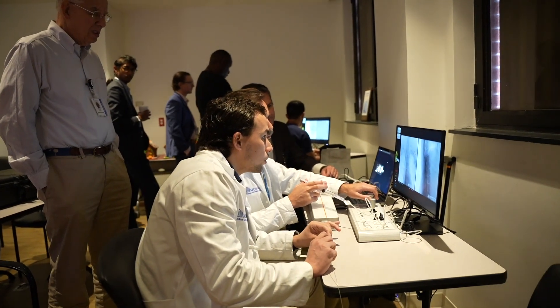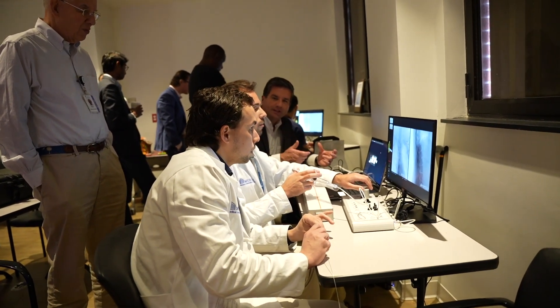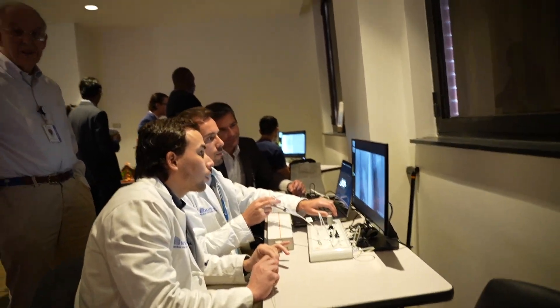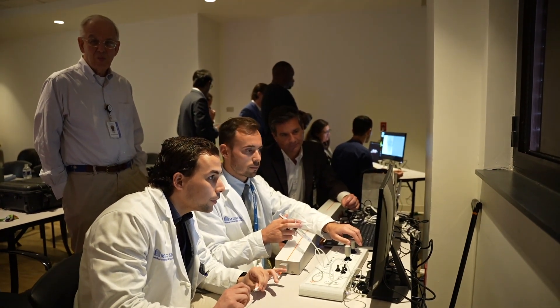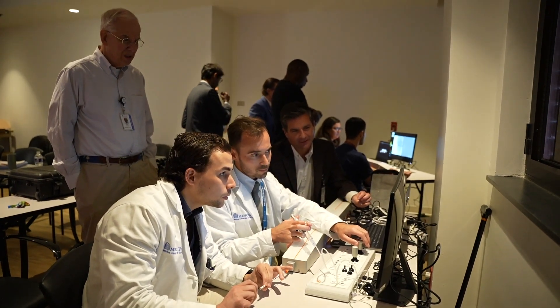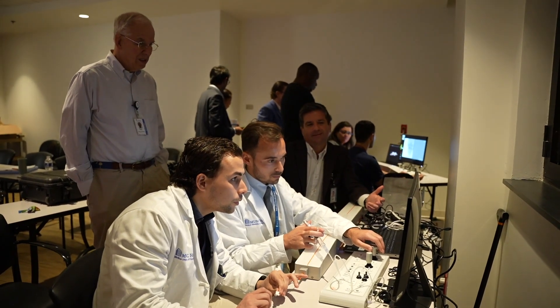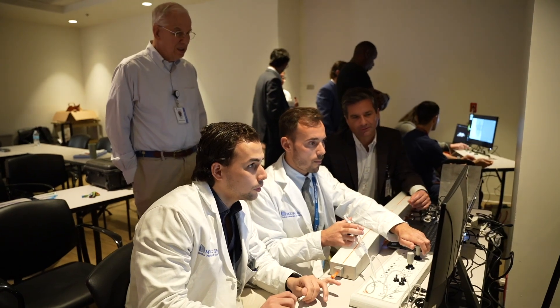Stop rotating. You see this energy built up when you stop rotating? You see how it kind of still keeps moving? When the car is there, you go down, whatever, and you pop. This is tough, but it's not going to be easy. Sometimes with these models it's just not really doable to do that maneuver.